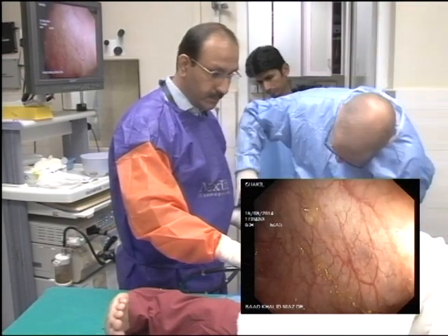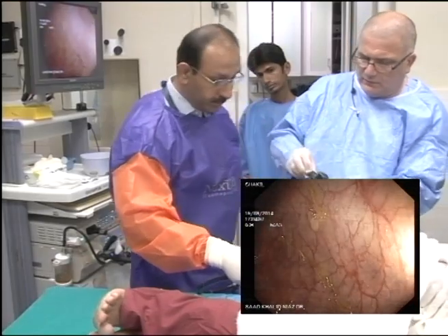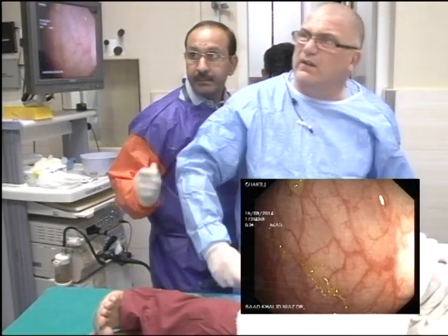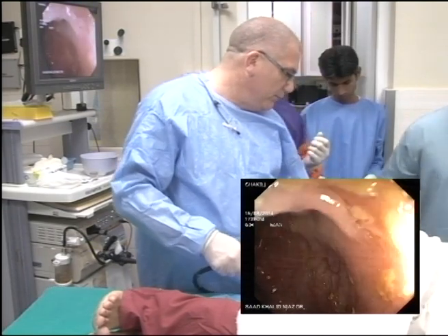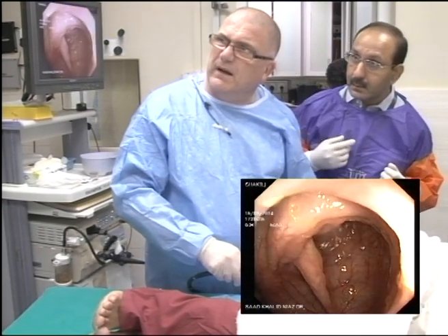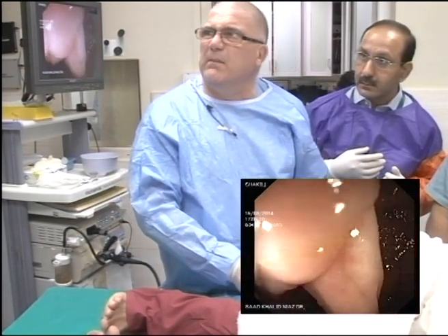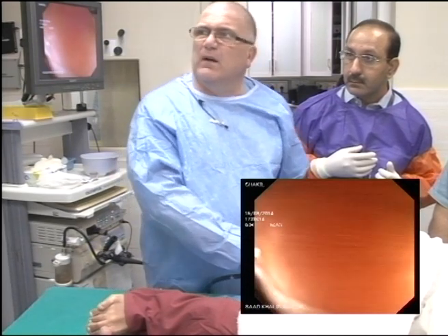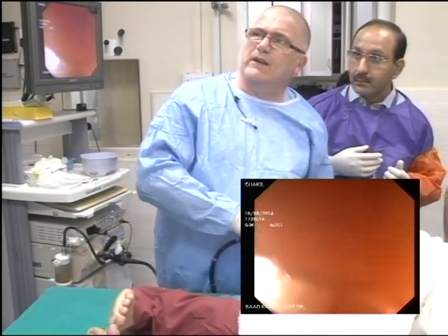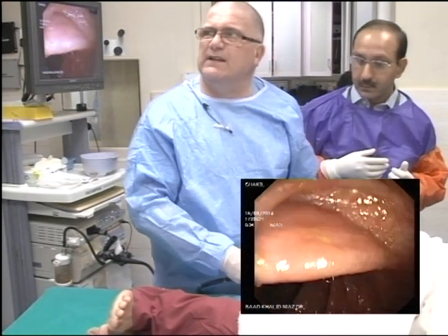Right, we've got too much air. You're pressing on the air there and you're filling him up. Let me just take it down, just a second, okay? Because I could tell he was getting very uncomfortable. So to reduce what you've got, back. Now he'll feel a little bit better, not too much better, because what happens is we shut off the right colon because of the air that you've put in, okay? So we have to actually get it to tease round.